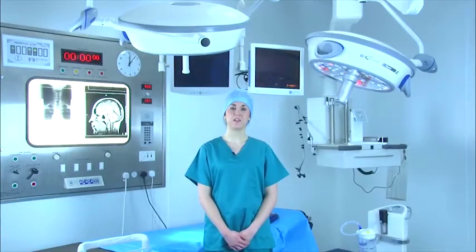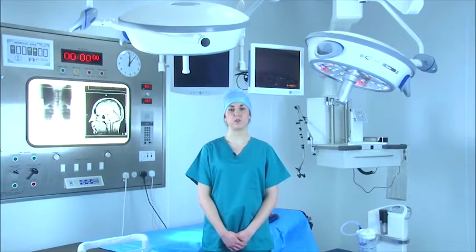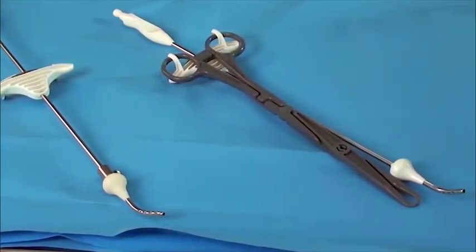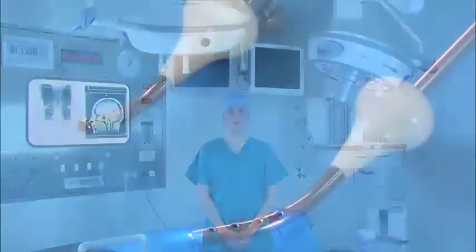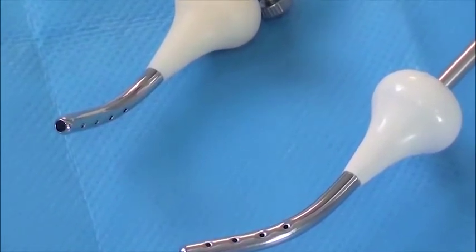Our Spachman cannulas provide a cost-effective single-use alternative to the reusable uterine manipulator which is difficult to clean. Made from high quality stainless steel to give strength for manipulation and with latex-free components. The spacing of the fenestrations at the tip allows optimum dye distribution, and the rounded and polished end further reduces risk of trauma to the uterus. This product can give the clinician the confidence of a clean, sterile instrument which performs safely and effectively.